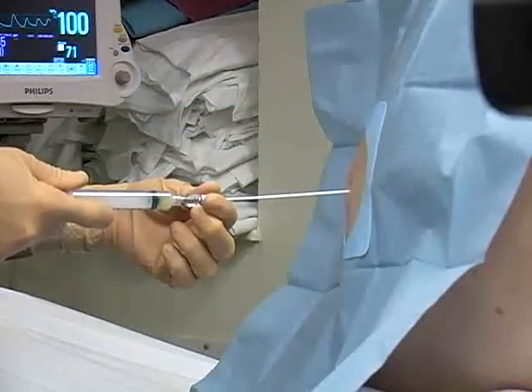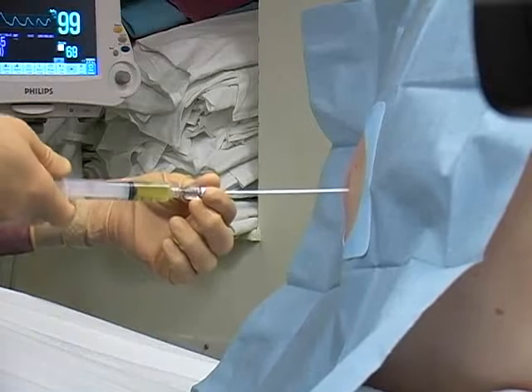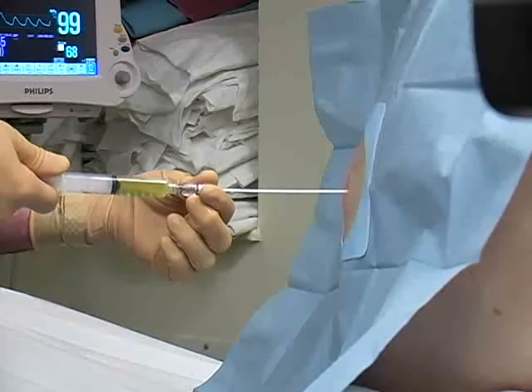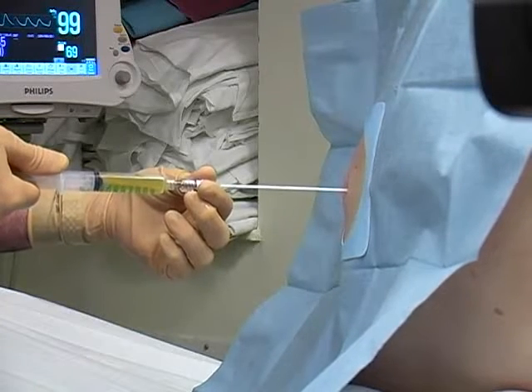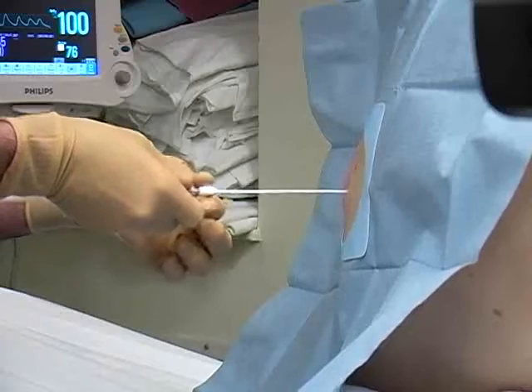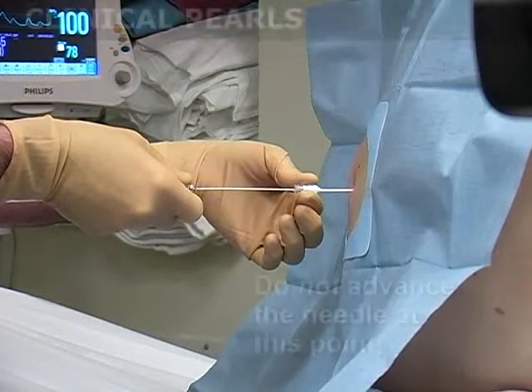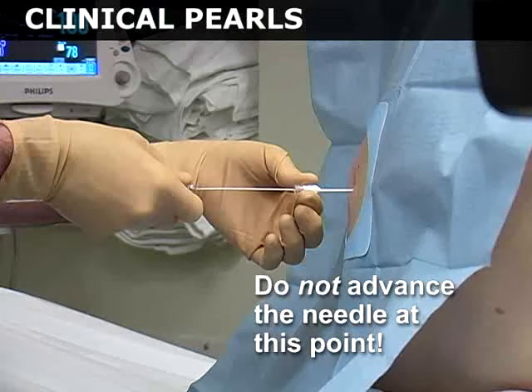Pull back on the plunger as you advance. Entry into the pleural cavity will be heralded by the aspiration of fluid into the syringe. Immediately stop advancement once fluid is obtained. Gently advance the catheter over the needle and into the pleural cavity. Be careful not to advance the needle at this point in order to avoid iatrogenic pulmonary injury.